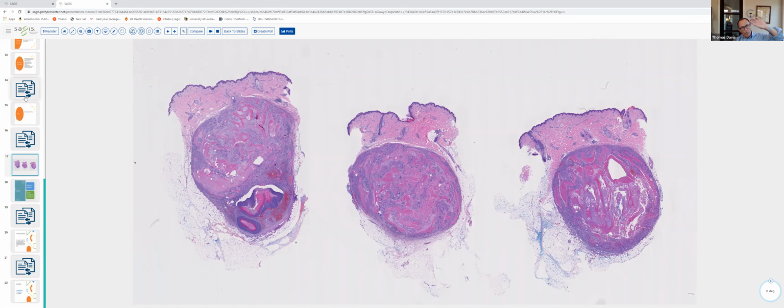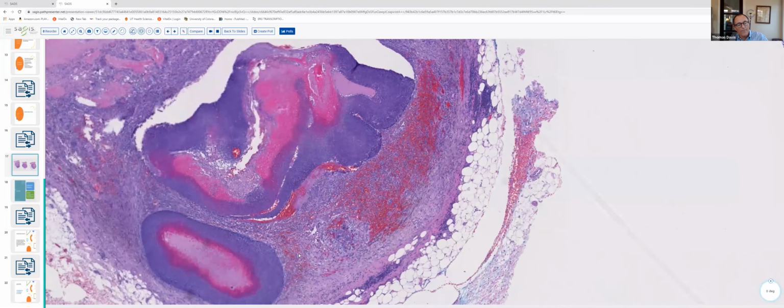So remember, we've got the three portions of the hair follicle: the upper portion, the infundibulum; the middle portion, the isthmus; and then we have the inferior portion, which is lined by matrical epithelium. The surface epidermis shows keratinization with interposition of a granular layer and that basket weave keratin, which is what we see in infundibular cyst. We just talked about the type of keratinization we see in the follicular cyst of the isthmus catagen type. In a pilomatricoma or matrical cyst, you really get an idea that these begin with cyst by looking down at the inferior portion.